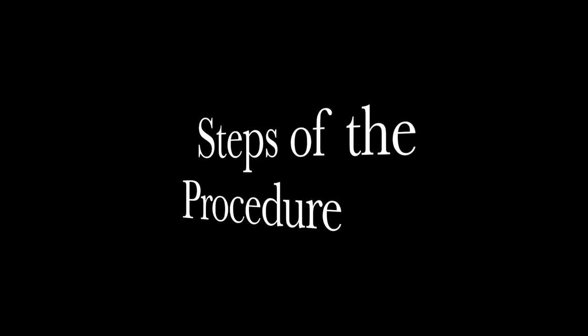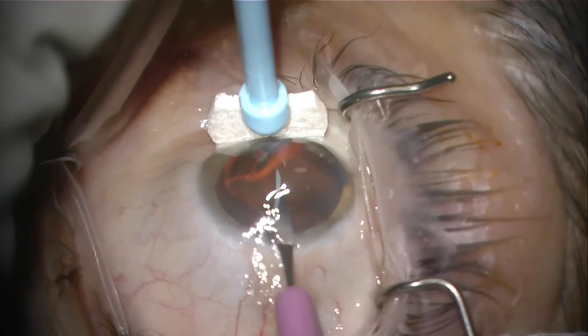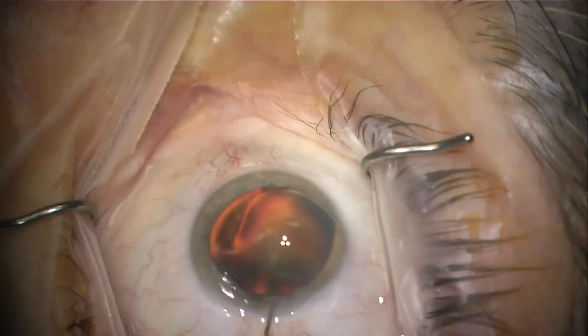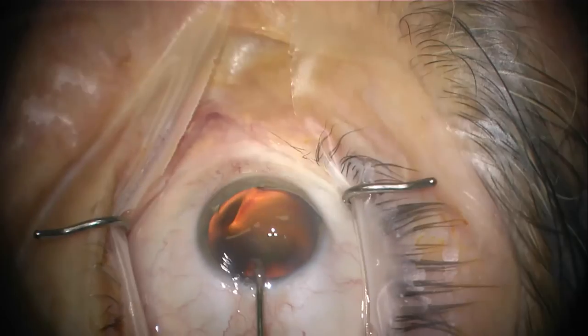Let's go over the steps of the procedure. The Kahuk Dual Blade can be used either alone or in conjunction with cataract surgery. Here I make an initial temporal incision, followed by anesthetic and then viscoelastic to fill the anterior chamber.